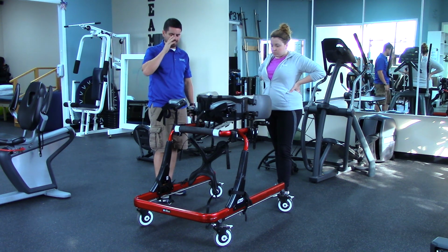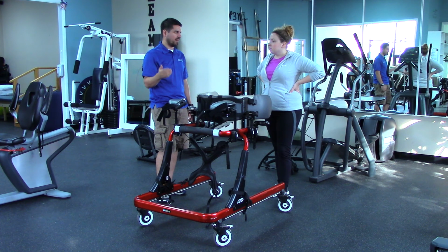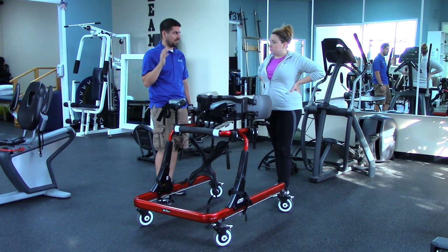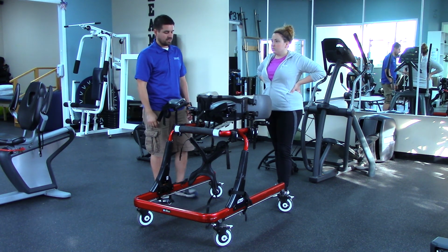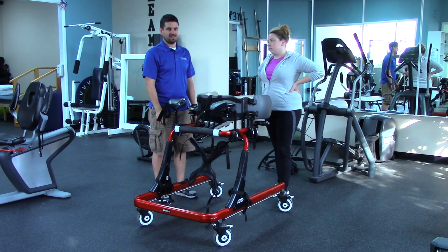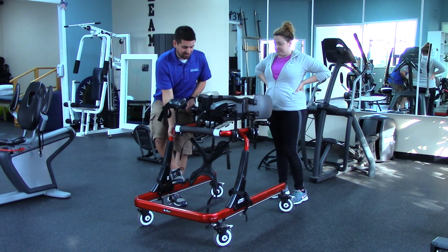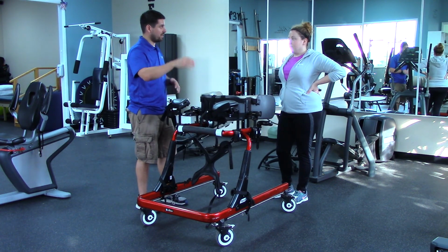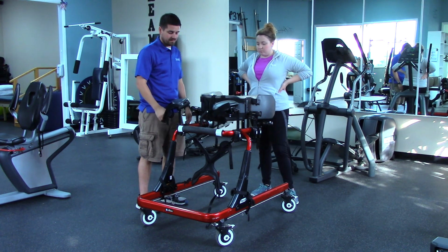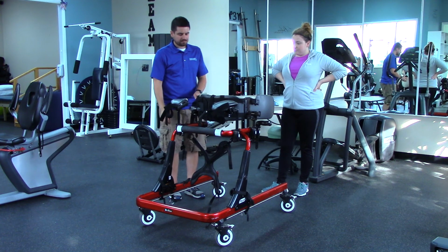However, if you're getting somebody dependent in here, you have to manually lift them up. So you have to lift essentially their body weight if they're not helping in standing. It's very awkward, and it usually takes two people. Although I've gotten another guy that's pretty heavy in here by myself. You start on this side, lift it up one, go to that side, lift it up one, until eventually you're up. It's definitely not ideal.